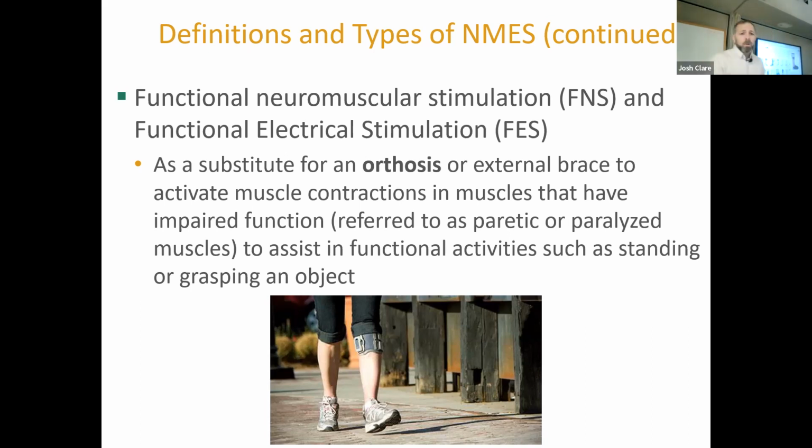So the option would be this orthotic with electrical current. What do you think the downside of these FES type devices are? I would imagine you probably can't go in water with it. Yeah, so there's one. How long do they last for in a day? If you're going to walk around at an amusement park for 6 hours, is this going to last 6 hours? Another fashion thing too, right? Yeah, that's another thing. Cosmetics is something we shouldn't just discount for our patients. Our patients don't want to walk with canes because they don't want to look old. They don't want to walk with braces, and so this is part of it. Does this fit under clothing or not? It also limits what clothing, just like the AFO would for footwear.